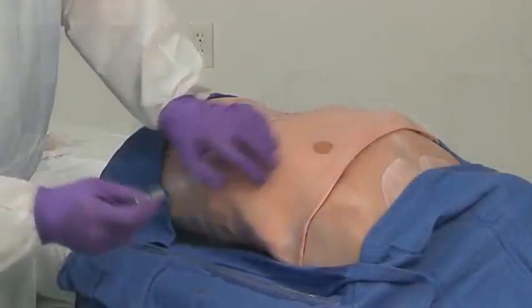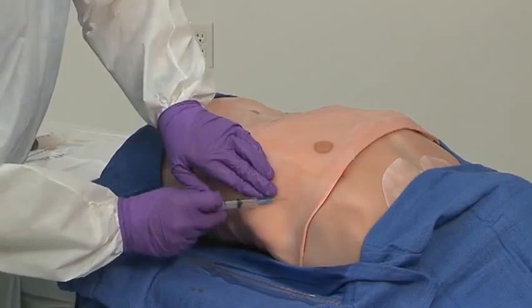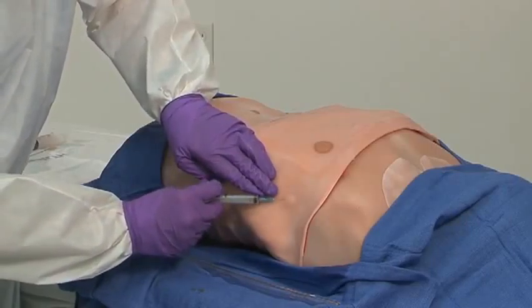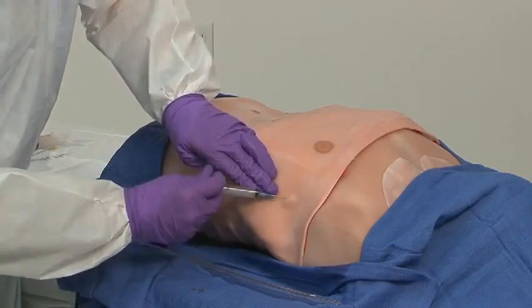If your patient is awake or conscious, it's a good idea to use some local anesthesia, as this can be a very painful procedure. Generally, we like to use some lidocaine with epinephrine, and we're going to infiltrate the skin over the area of the landmark, which is about the fourth or fifth intercostal space, just anterior to the mid-axillary line. I'm going to raise a little bit of a wheal.